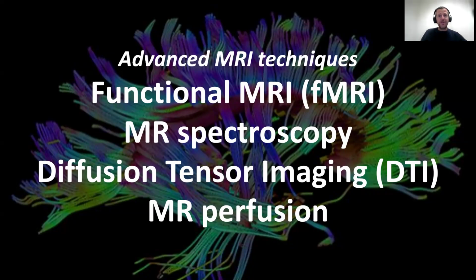I'm a neuroradiologist working at Ghent University Hospital in Belgium, and this video will provide a short introduction to the physical basis and interpretation of some advanced MRI techniques. These techniques are called advanced. I'm going to introduce them to you. So this is going to be a basic introduction for people who are new to the field or who just want a refresher on techniques that are not often used in daily clinical practice unless you work in a university center where they are more standard or you do research or something like that. I'm going to talk about functional MRI in this presentation, MR spectroscopy, diffusion tensor imaging, and MRI perfusion.